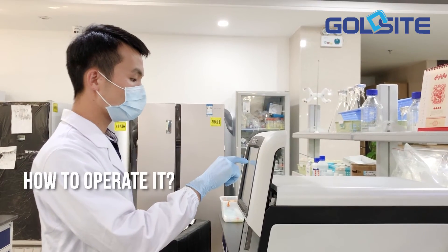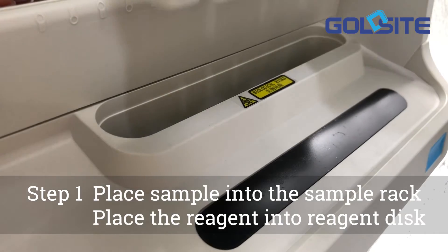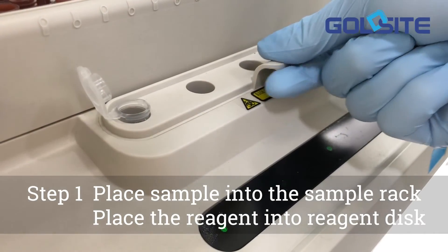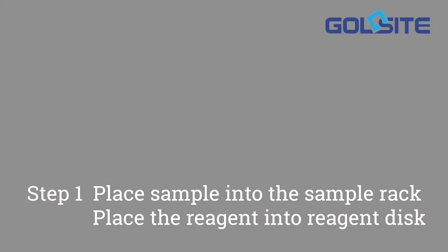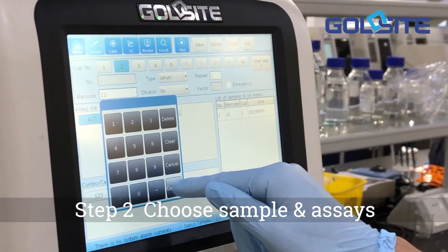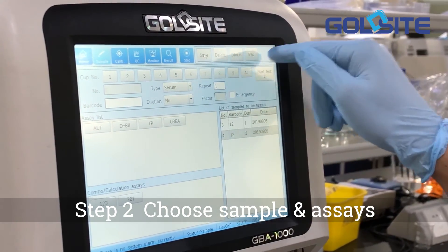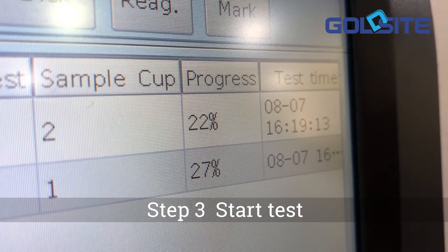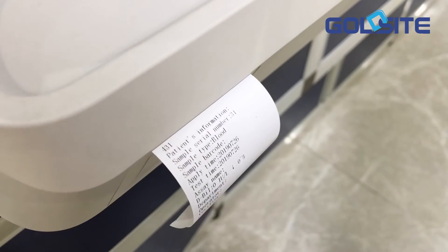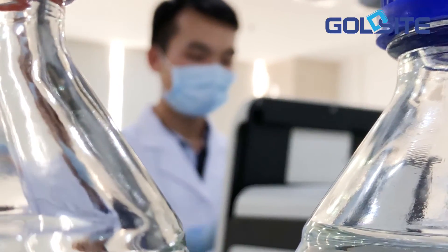Now let's turn to how to operate it. Step 1: Place the sample into the sample rack, then place the reagent into the reagent disk. Step 2: Choose sample and assays. Step 3: Start test. Results will be displayed and printed out automatically after samples are programmed and loaded on board.